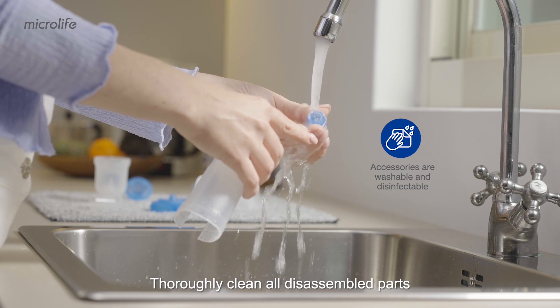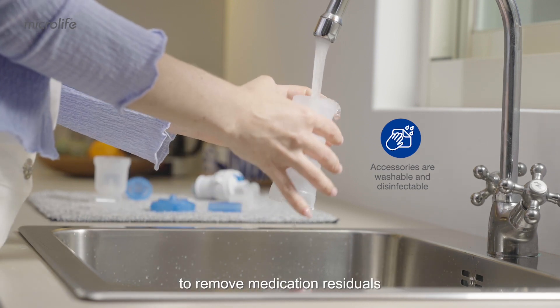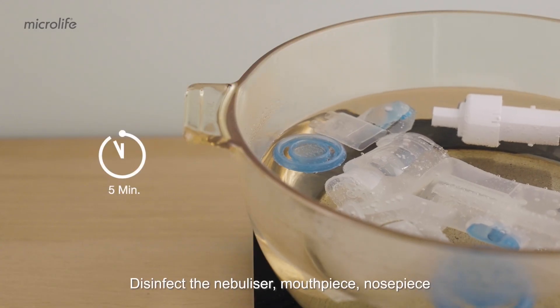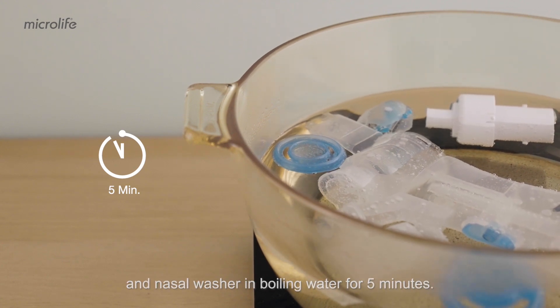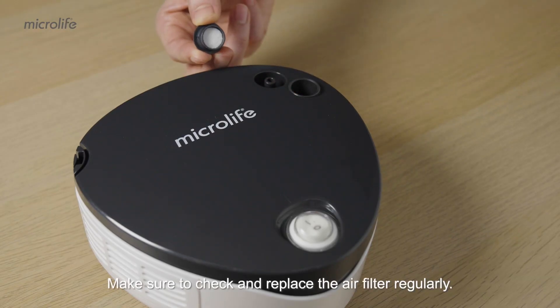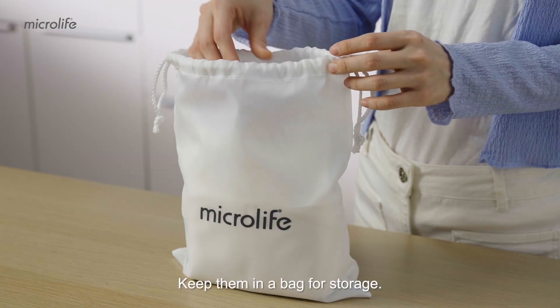Thoroughly clean all disassembled parts with warm tap water to remove medication residuals and impurities after each use. Disinfect the nebulizer, mouthpiece, nosepiece, and nasal washer in boiling water for five minutes. Let all parts air dry. Make sure to check and replace the air filter regularly. Keep them in a bag for storage.